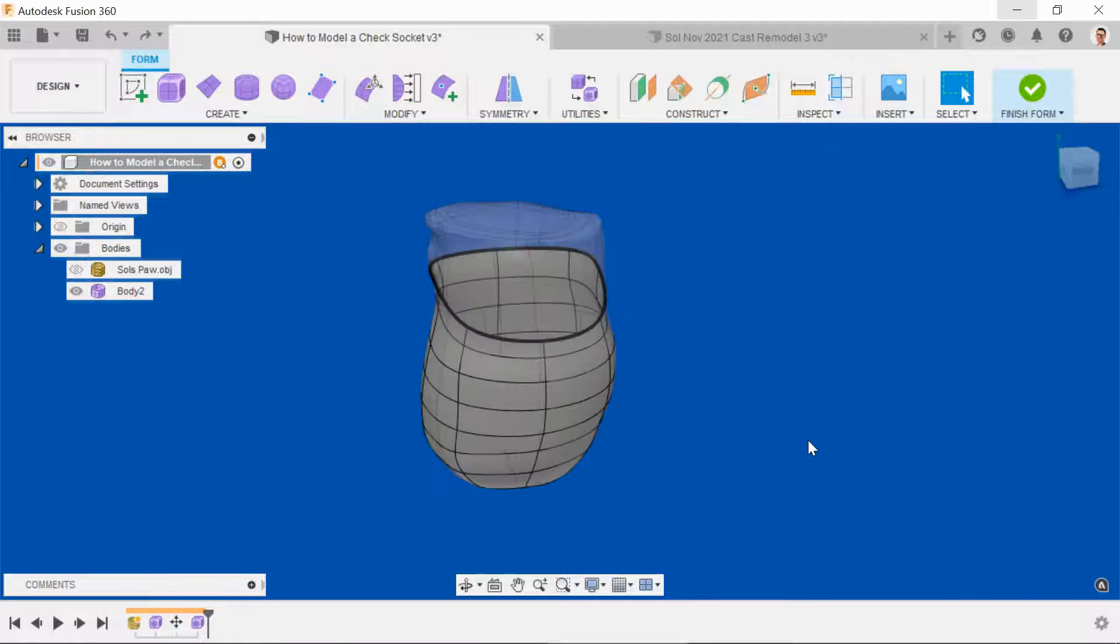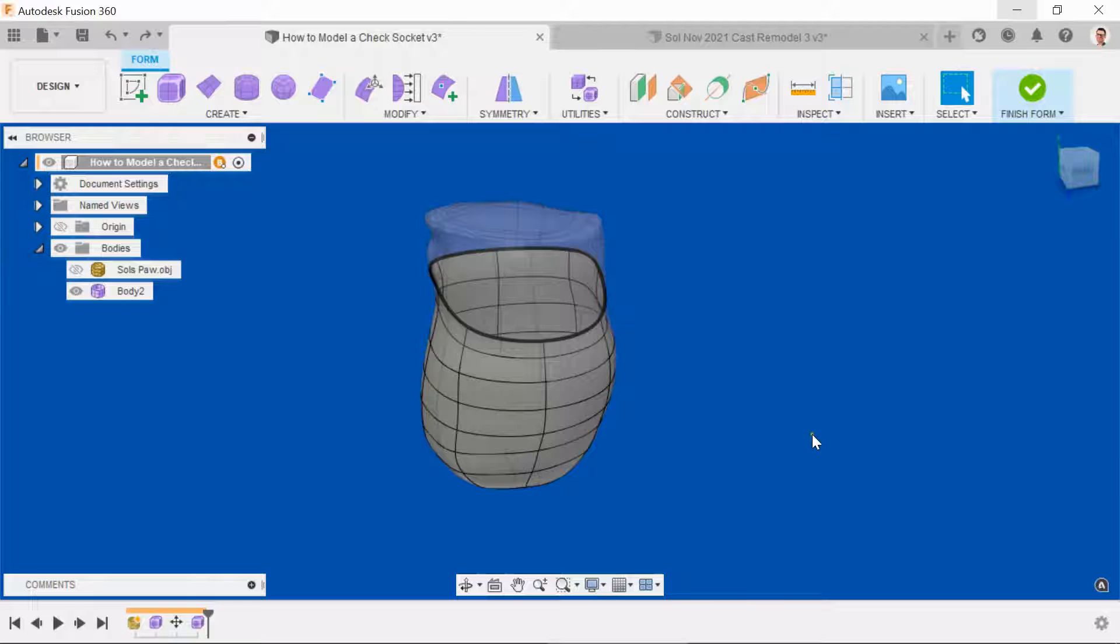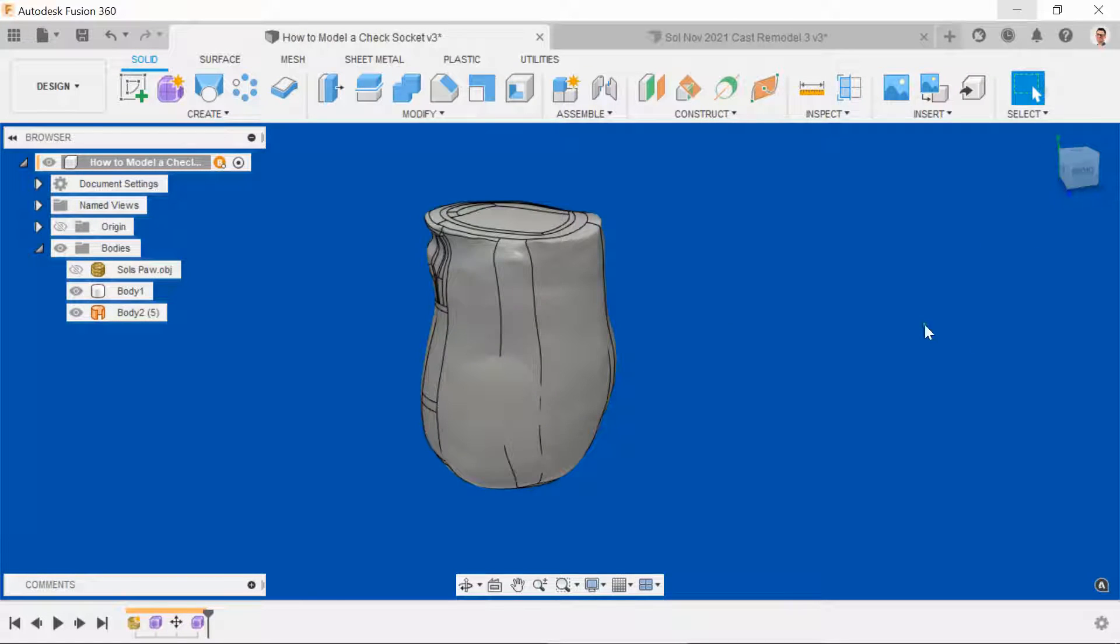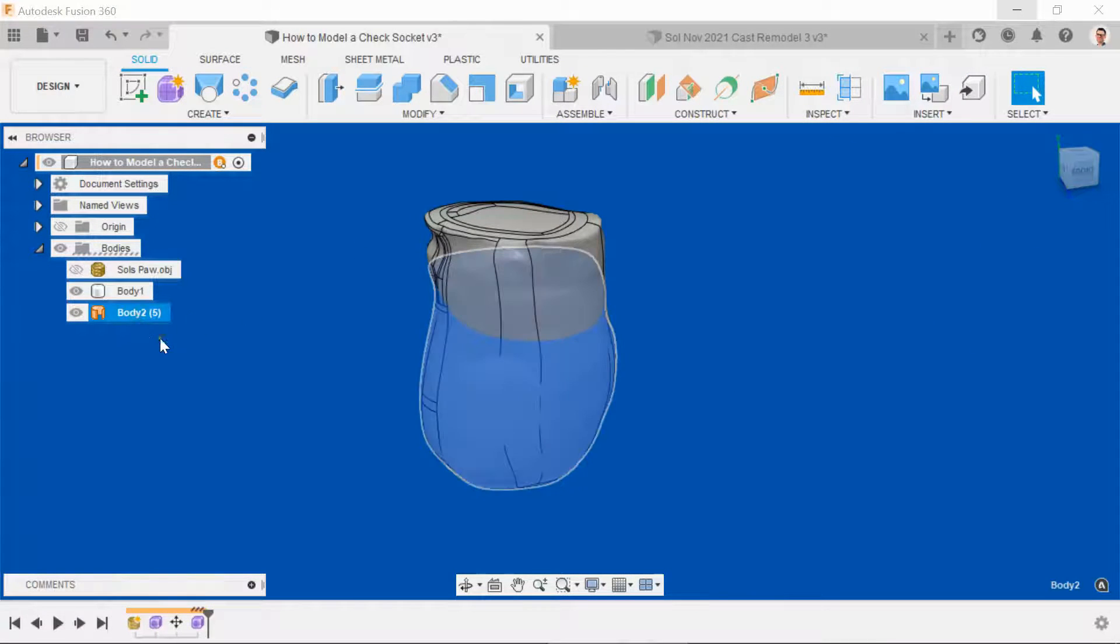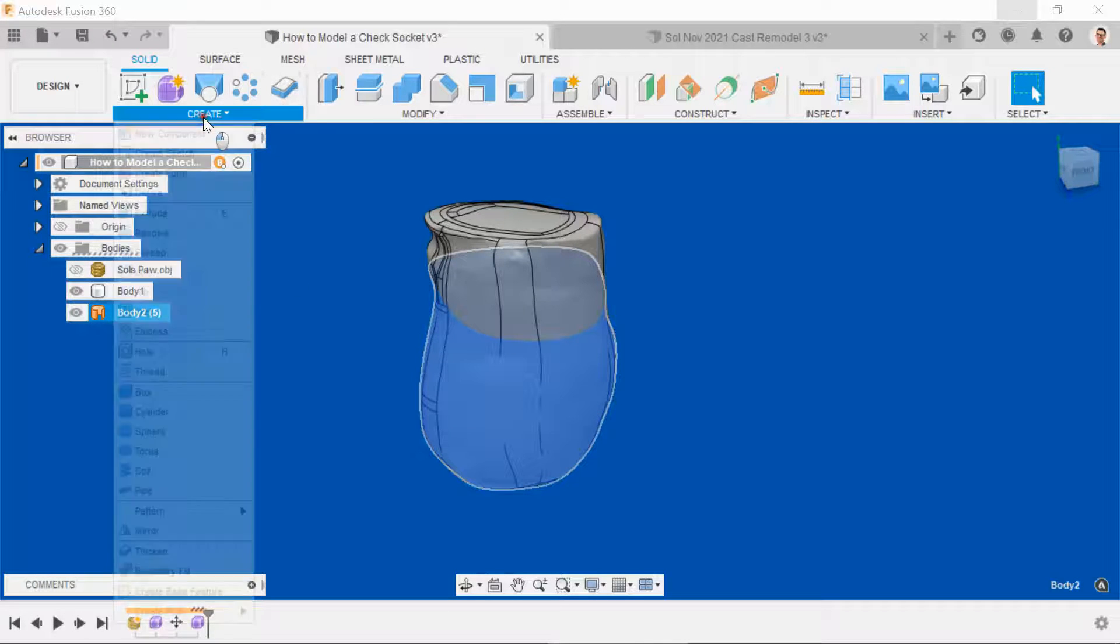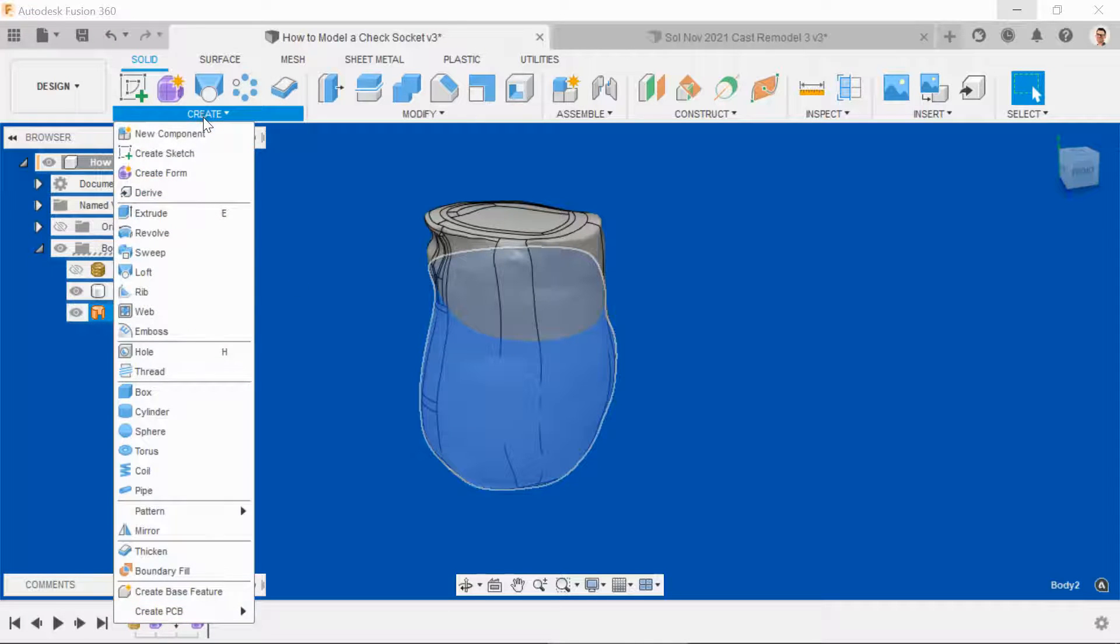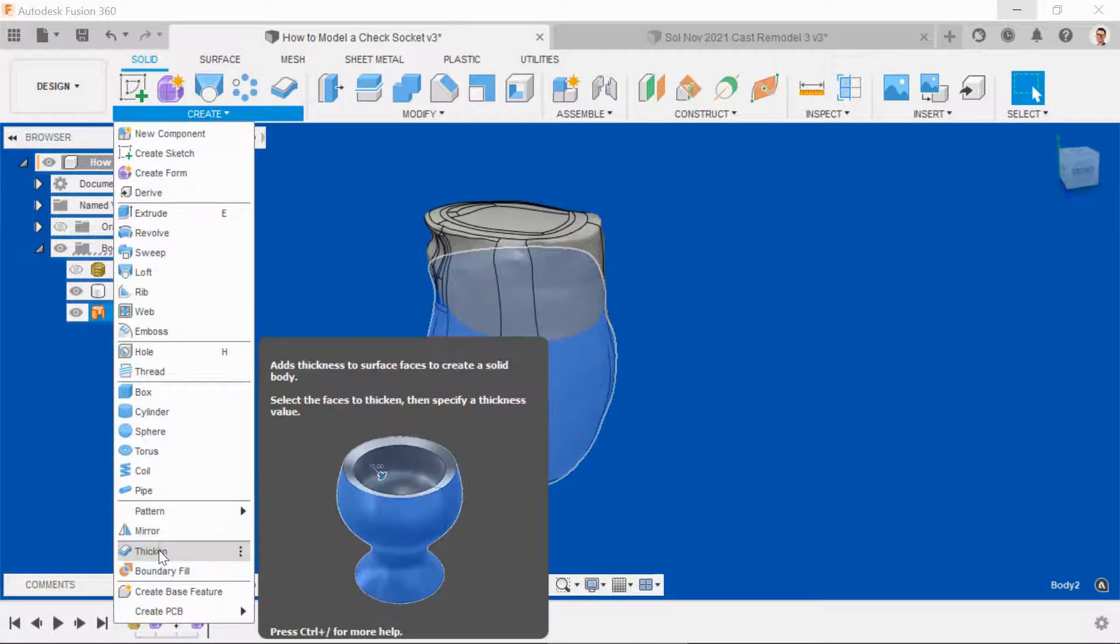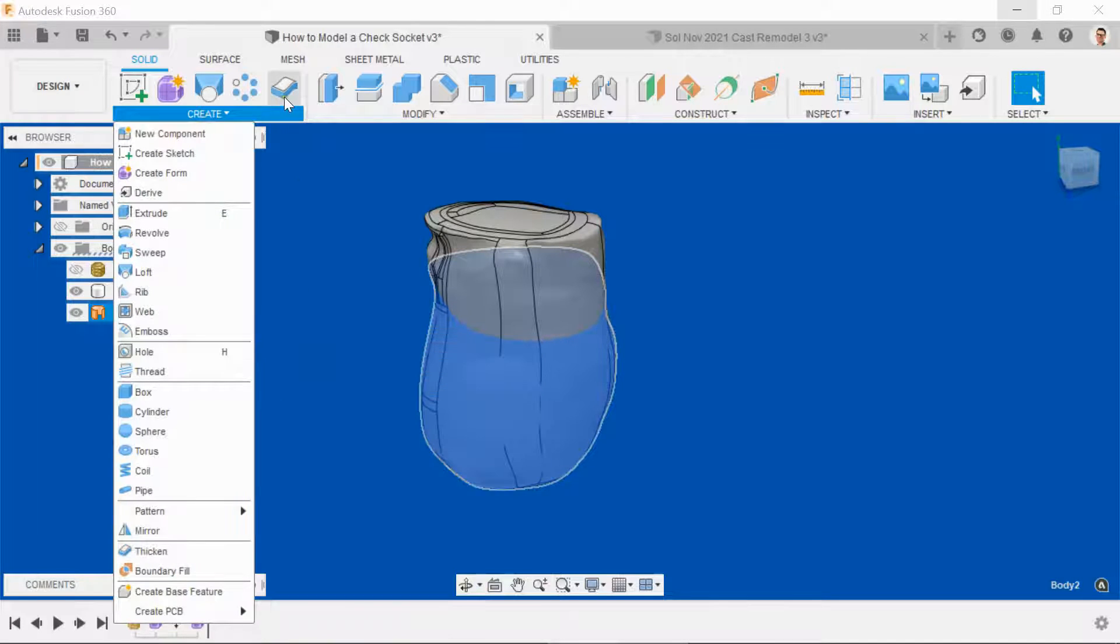Once you're happy, it's time to turn this into a solid body and do some proper analysis using the T-spline. Hit finish form, select the body that we've just created, and go to Create and Thicken. I've also added this to my shortcuts.